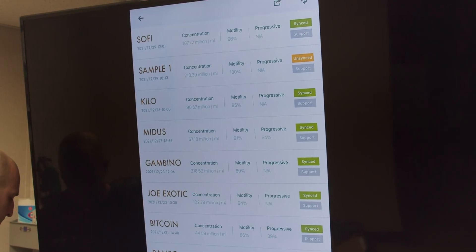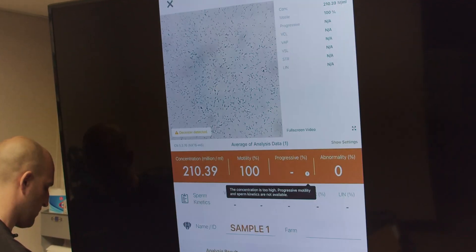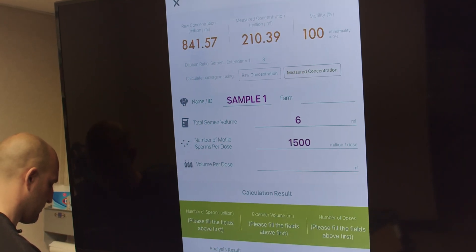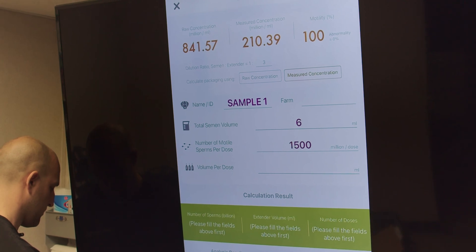Navigate through client data easily using the measurement history button. All client data stores to the cloud for safe long-term data storage. Another amazing feature of the iSperm system is the semen extender ratio calculator to make shipping semen a breeze.